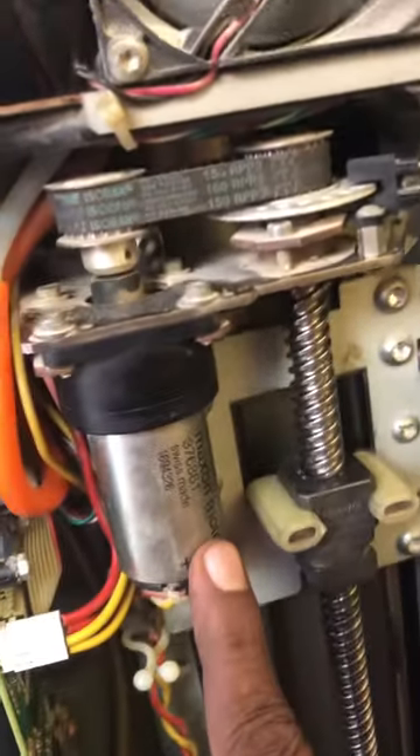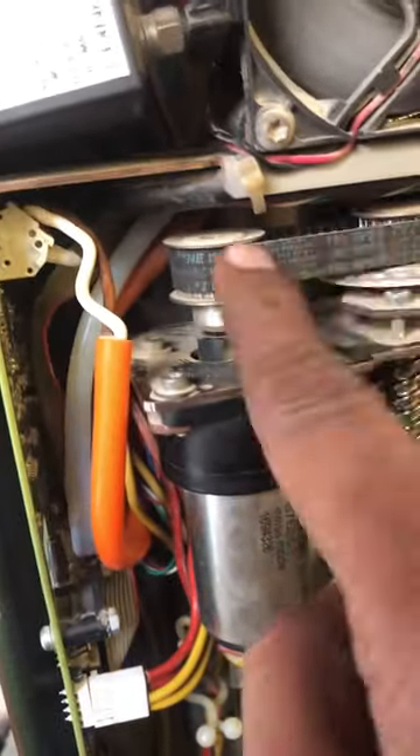This is lift motor. This is lift pad. This shaft is going to lift up and down.